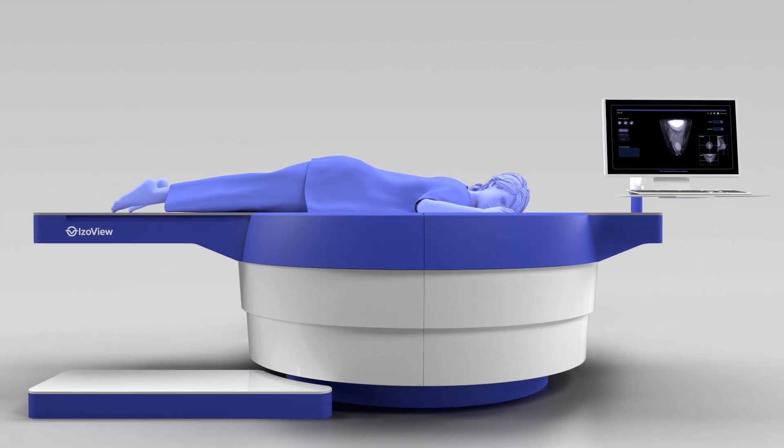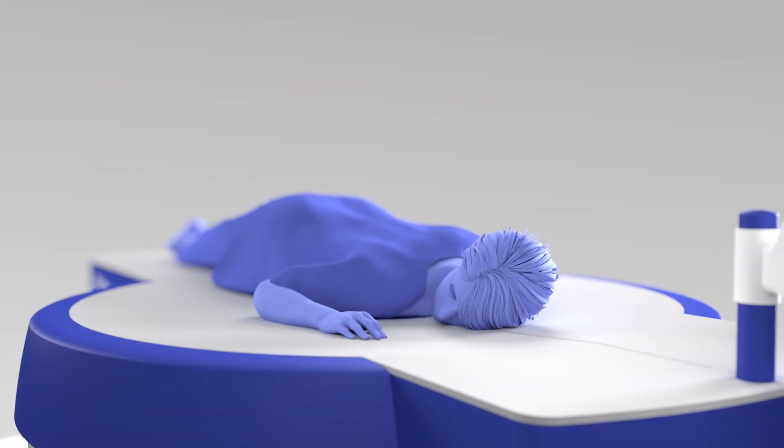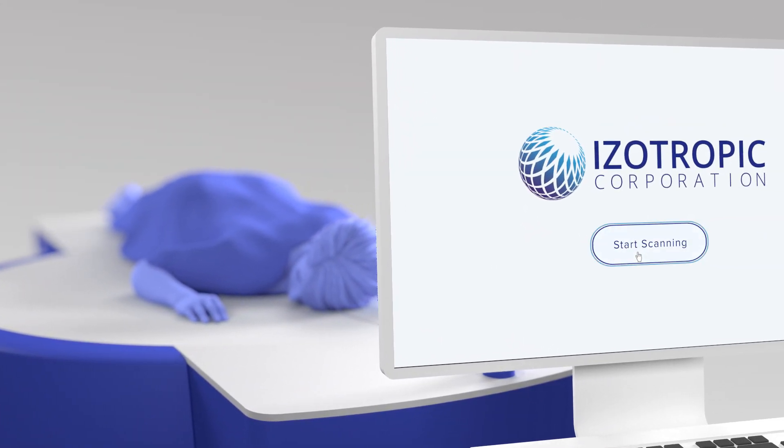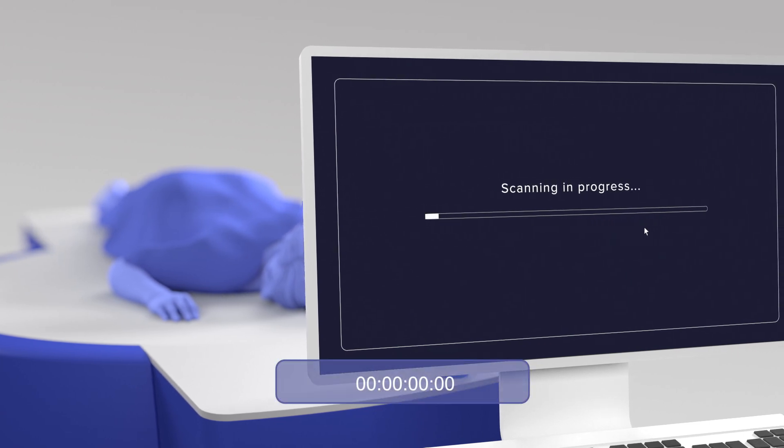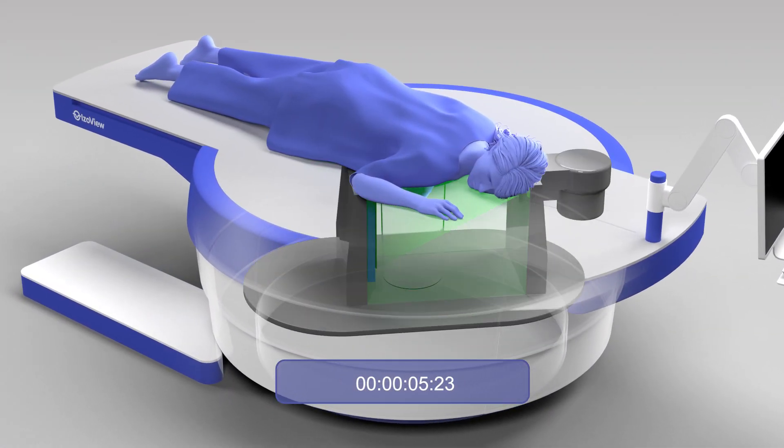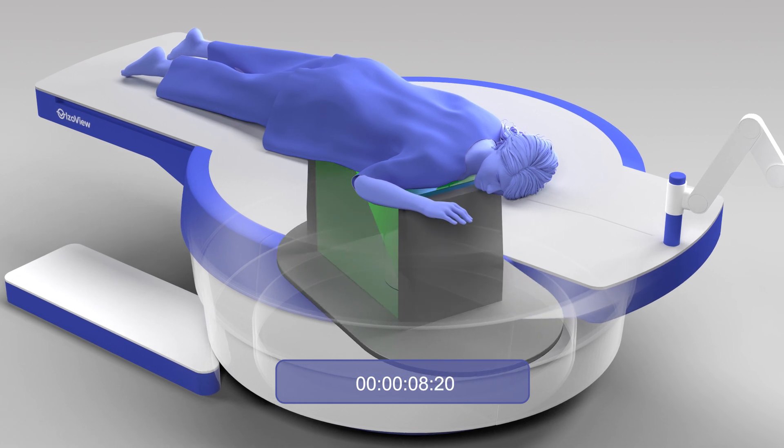The controls are simple, relying on a few easy clicks by the technician to start the imaging process. Scanning is rapid, with Isoview capturing 400 to 500 CT images in just 10 seconds.